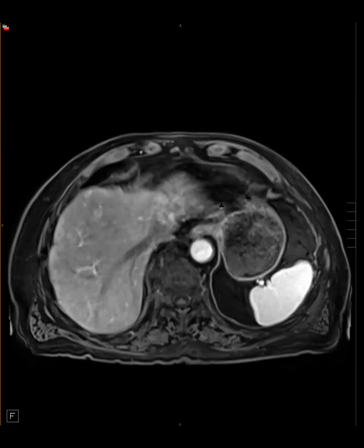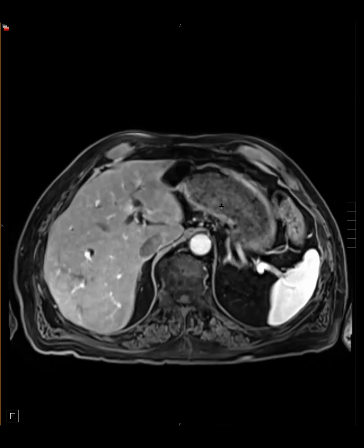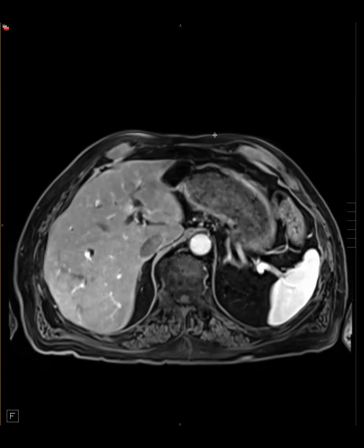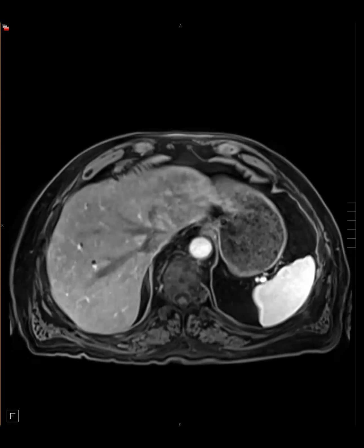Yeah. Cocci is more in the Southwest, right? Do you guys see a lot of it? We have quite a bit. Yeah, I think they throw it into every chest CT. Yes. Have you seen it in the liver? When I saw this, I was like, well, maybe it's not Cocci. What if it's like squamous or something that's metastasized, even though that's weird, but I don't know. Have you guys seen it in the liver? No. Okay. Never seen it in the liver.